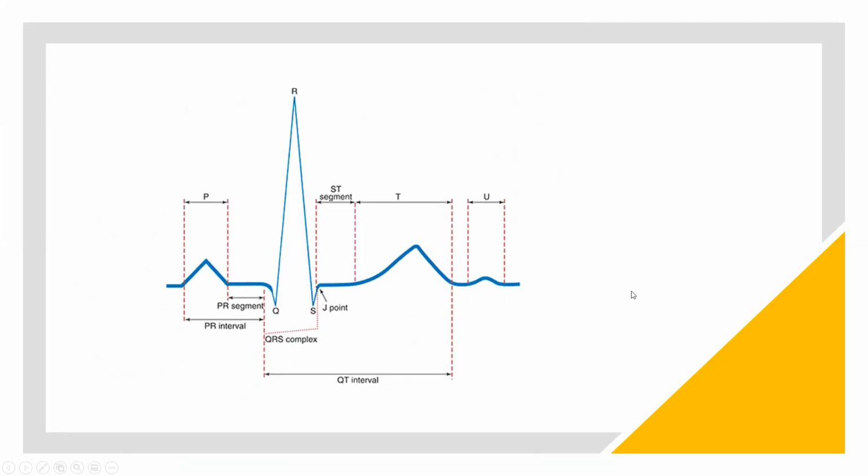All right, here it is again for you guys, okay? So the P, this is how we're going to measure when we talk about our EKGs. We have a P wave that we're going to look at. We have a PR interval that we need to measure. We have a QRS complex that we need to measure. Sometimes you'll see people measuring the ST segment. We can if we want to, but the T is the other kind of thing that we need to watch for.